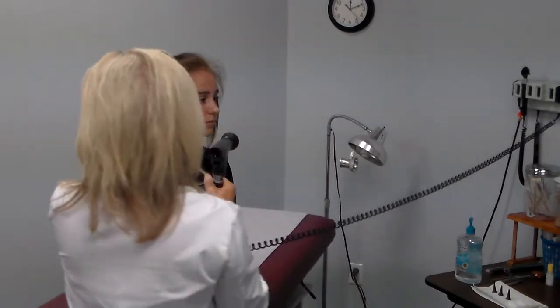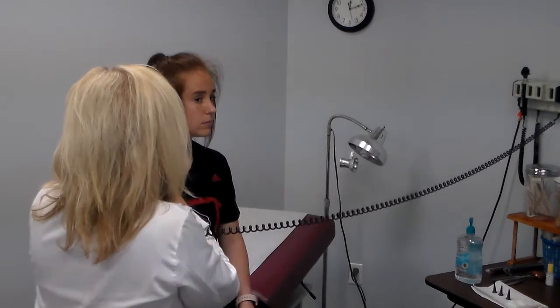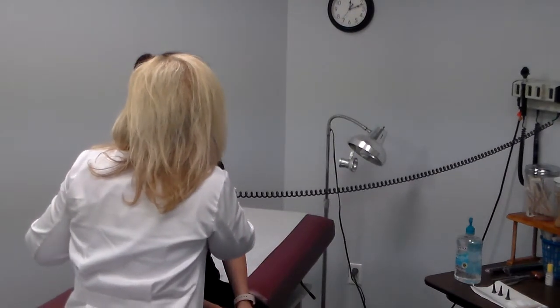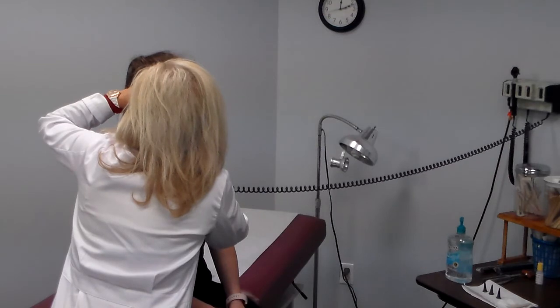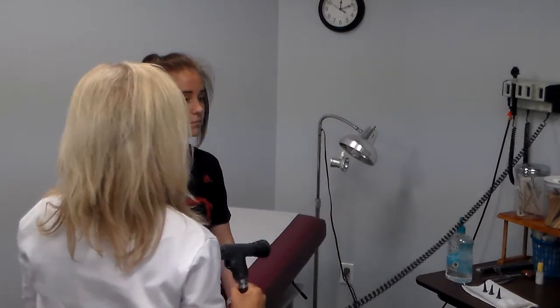Now I'll examine her right eye. So I move the scope into my right hand. I'm going to find the red eye reflex coming in at about a 30-degree angle. I've got it right here, coming in. Look into the light, please. I can visualize the retina, the optic disc, and the blood vessels. This completes the examination of the eye.